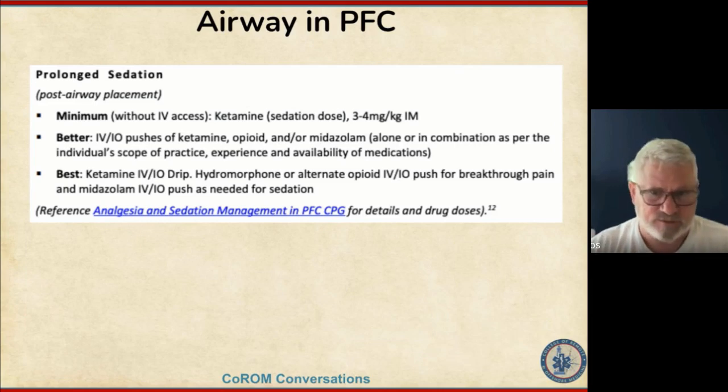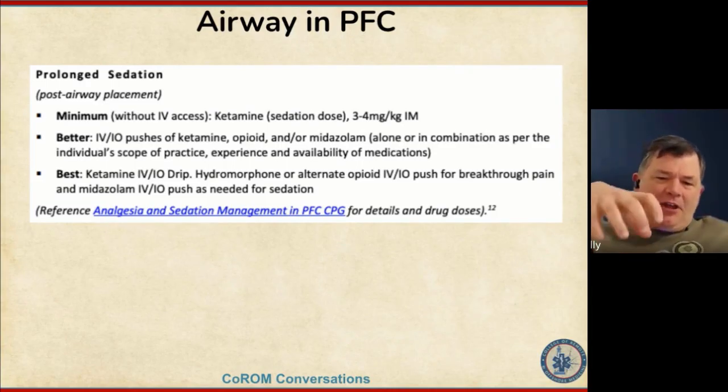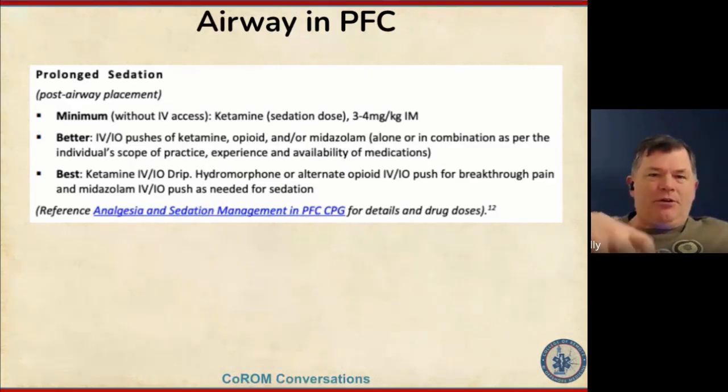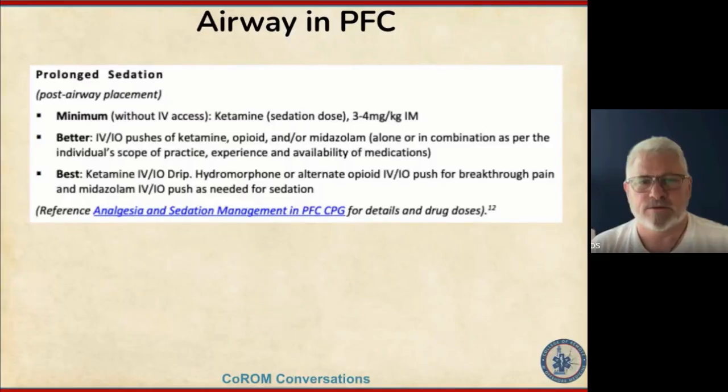Instinctively, I see people too often grabbing the top of the bag and fighting themselves. If they break the seal, it's also a matter of muscle effort. It takes more muscle to keep it up on top. And I'm a lazy medic. If I'm going to be doing this for 8 hours, there's no way I'm going to go to muscle failure. So yeah, hold it underneath. You're not going to be able to do it for 10 minutes otherwise.